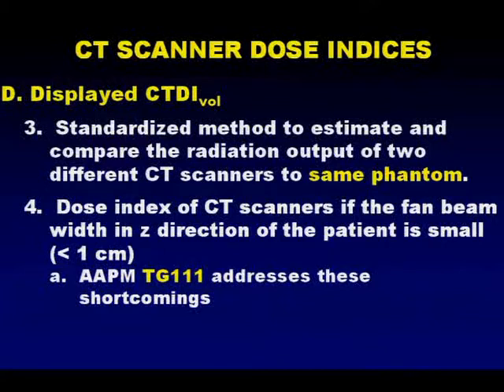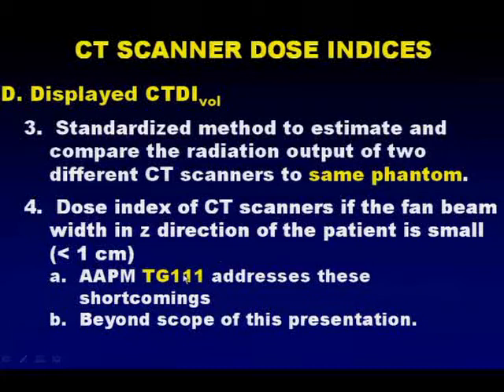Now you're aware that a number of our colleagues have been working over the last few years, and as a result, TG111 was published. TG111 addresses the shortcomings of the CTDI dose measurement protocol in that it doesn't capture all the dose tails associated with our multi-detector, relatively wide fan beam CT scanners today. But I'm not going to say anything more about that. That's beyond the scope of this presentation.